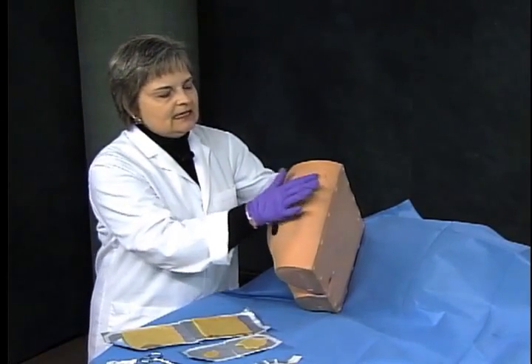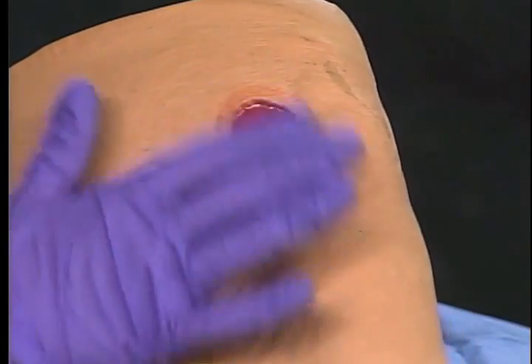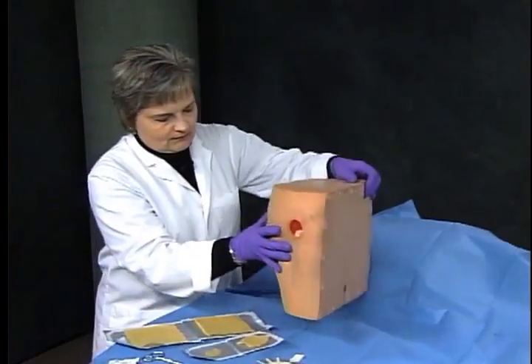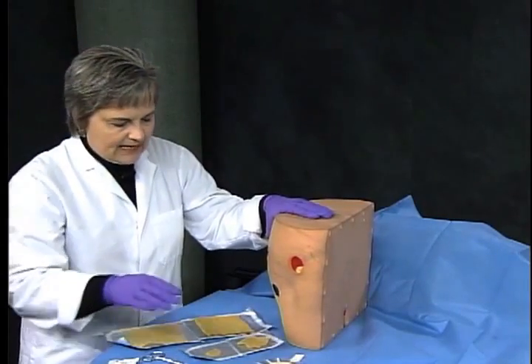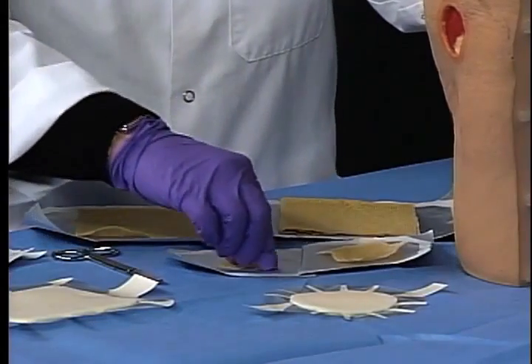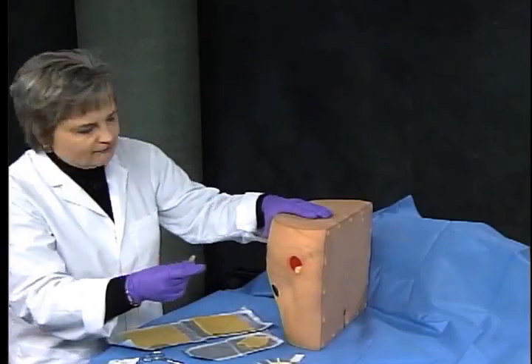Now, we're going to be focusing on this particular wound that is over the anatomic model's trochanter, and as you can see, it's a superficial, full thickness wound, and so there's not a lot of depth. So what we're going to be doing is, first, we're going to be demonstrating how you apply Tegaderm AG Mesh when the dressing is cut. And for the purposes of our demonstration, I've already prepared the dressing, and I've cut the dressing to the exact size and shape of the wound.